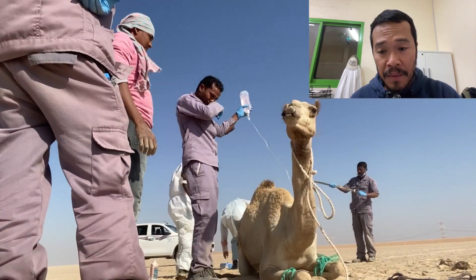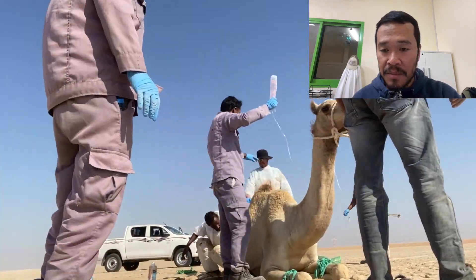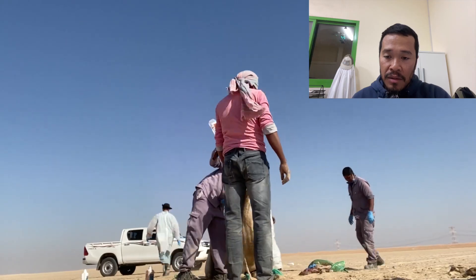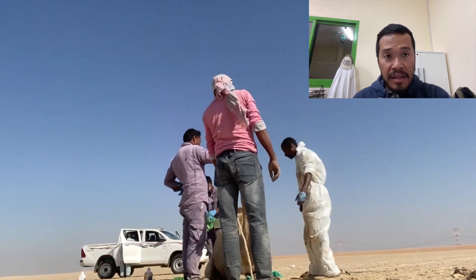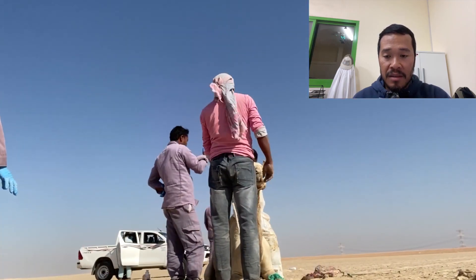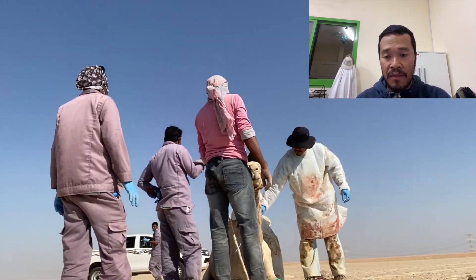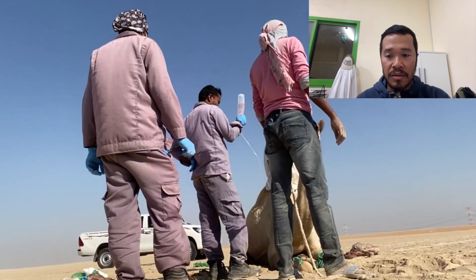We needed to give the dam a saline solution with B vitamins. Once that's done, we released the animal and removed the restraints. As you can see here, we're just finishing up applying the saline solution.